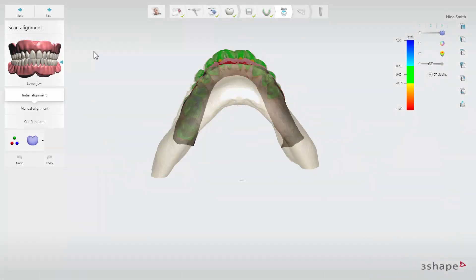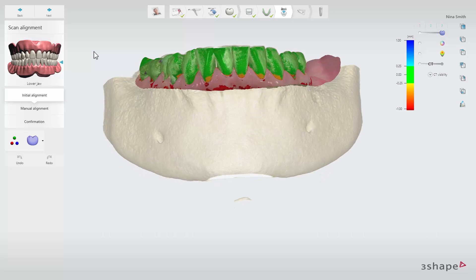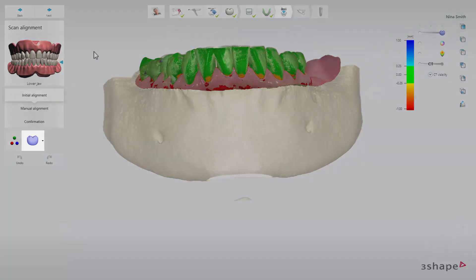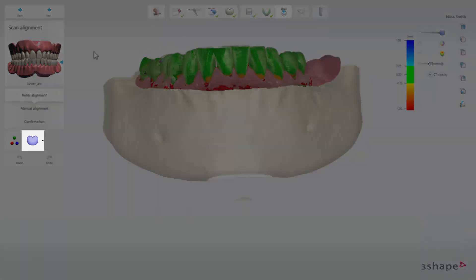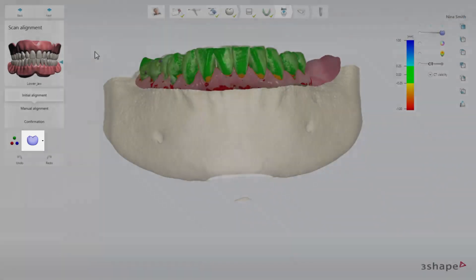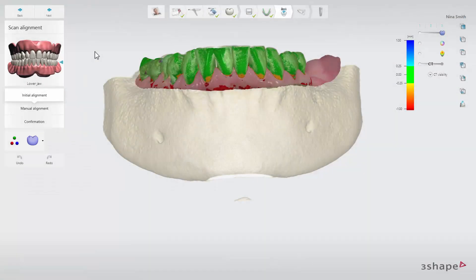In the scan alignment step the software will initially suggest an alignment between the CT scan and the surface scan. If you also included a pre-prep scan in the order you can choose to align to this instead by selecting it from the drop-down menu. Please note that the pre-prep scan has to come from the same case or order workflow to align properly.